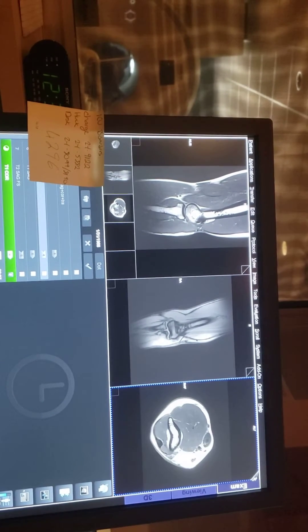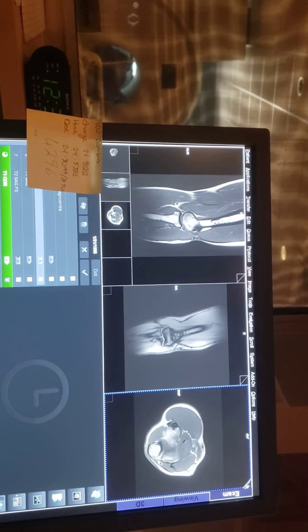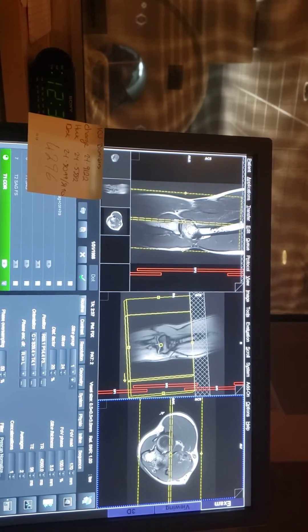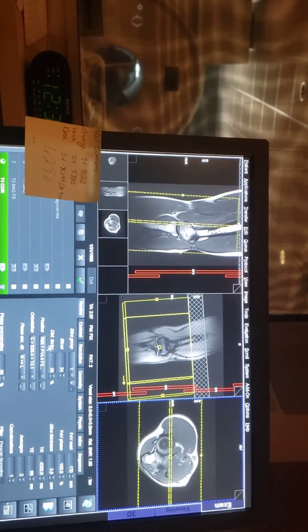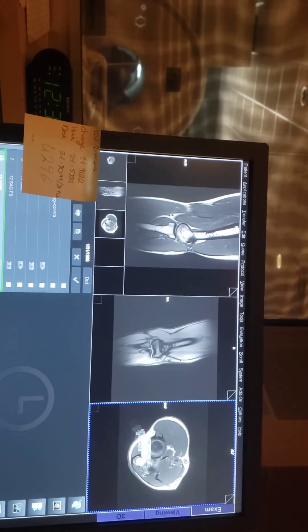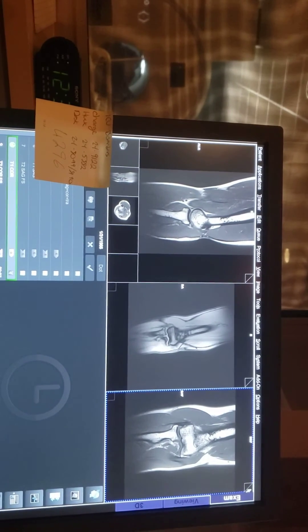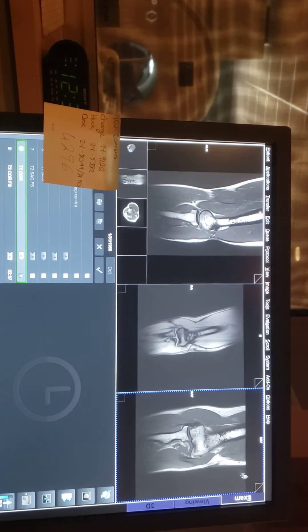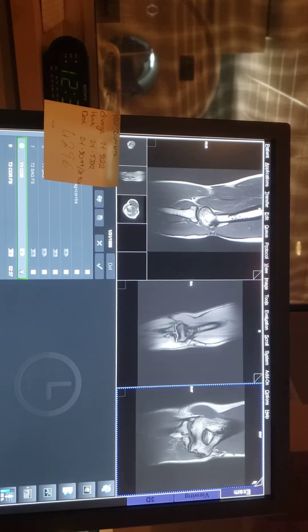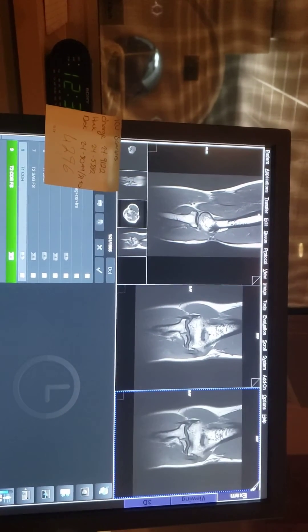Now we're just waiting on the Coronal to come up. So the angle is just right to left, and for Axial and Coronal I'll do A2P. There go my Coronal picture — just waiting on it to finish. This is the Coronal.